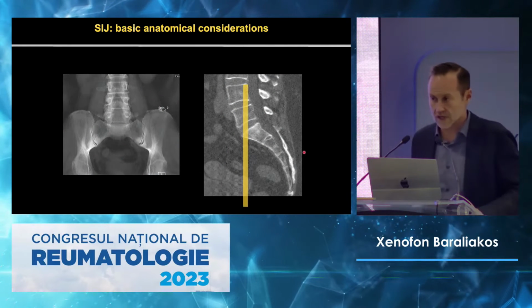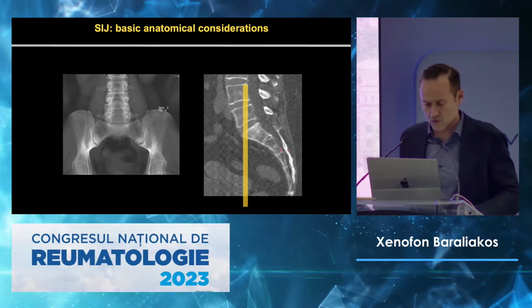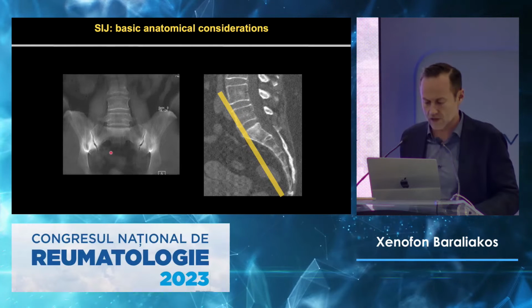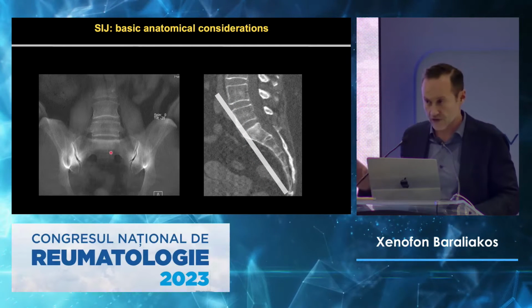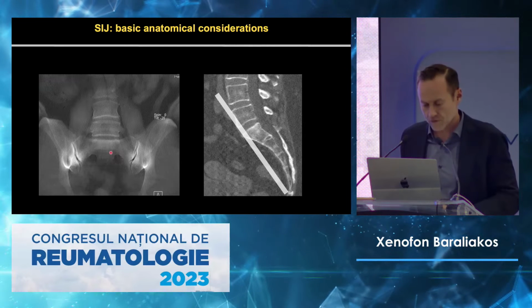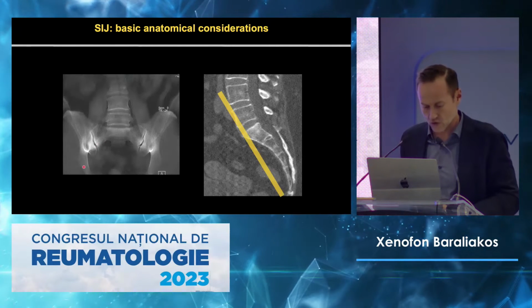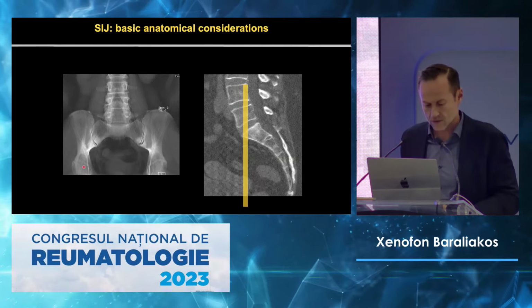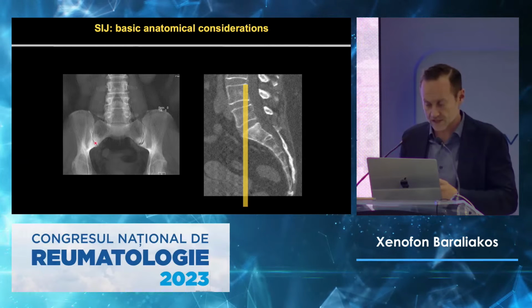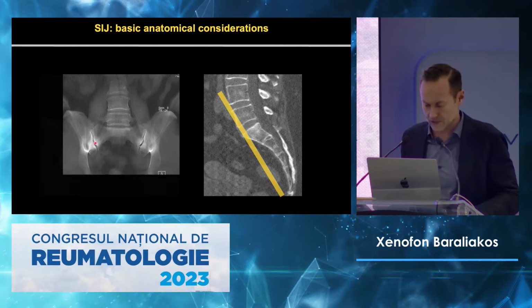And that is because, again, it's different on the MRI, but when we stand, we see the sacroiliac joints like this. Usually, or normally, they go like this. This is a 3D reconstruction we've done, and I took the images of a CT of a patient who came with back pain. Here you see how this width will change. I go back. So the sacroiliac joint itself enlarges or decreases its width based on how the patient is lying on the bench.